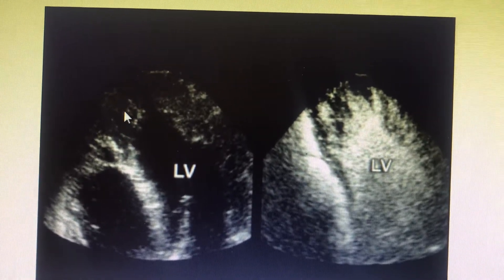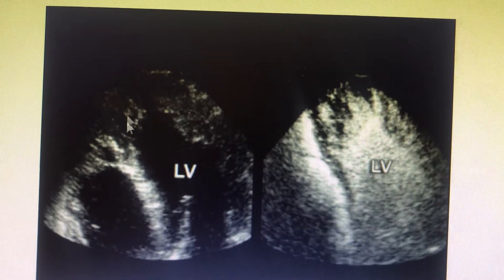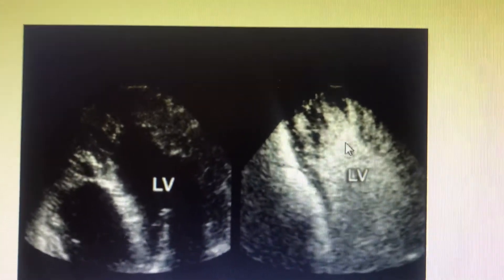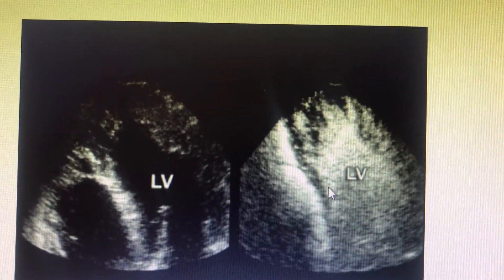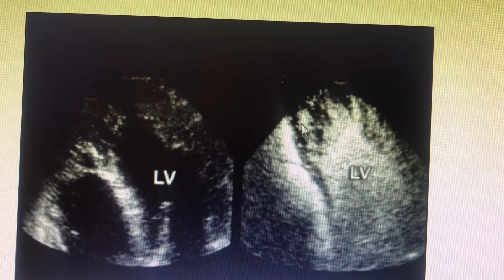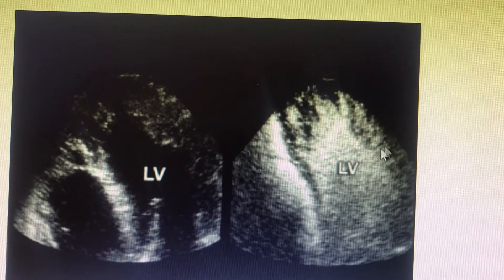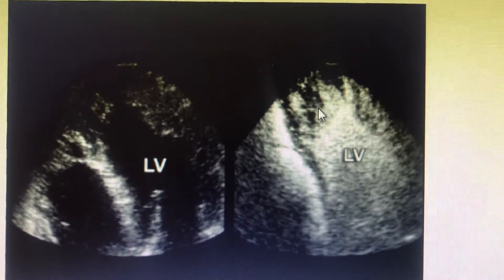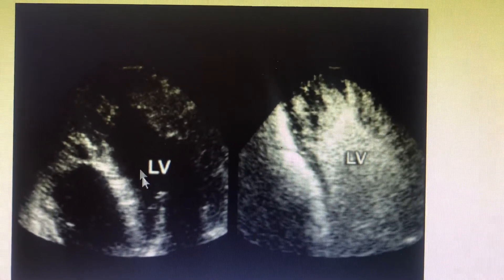Many times we can feel that it is trabeculation, or we can see that it may be a clot also, because there are something moving away from it. You can put in the color or you can put a contrast here, and in the early contrast you can usually differentiate it from the muscle. You can see the trabecular recess going inside, and you can measure the thickness of the trabecular recess to the normal myocardium.